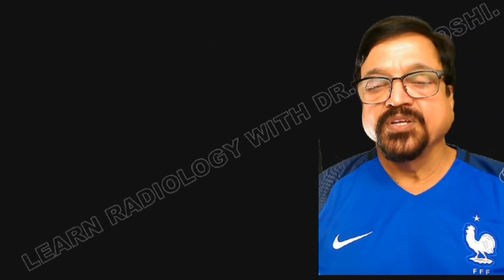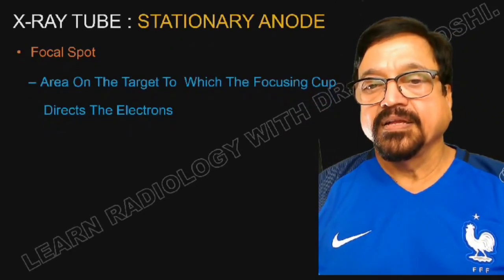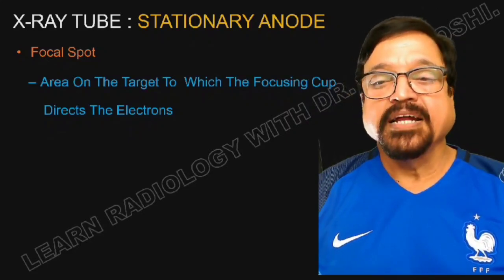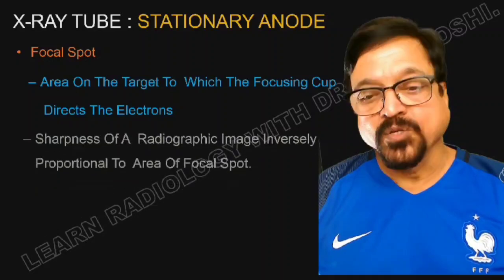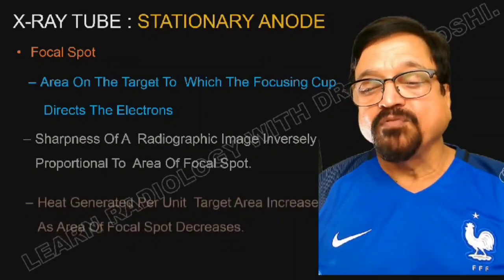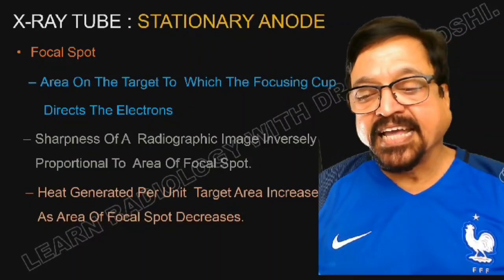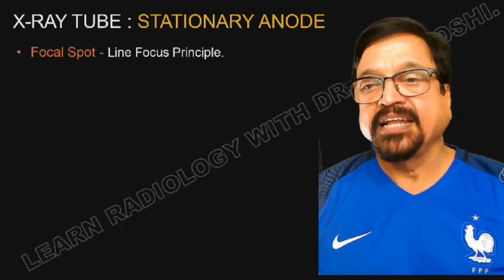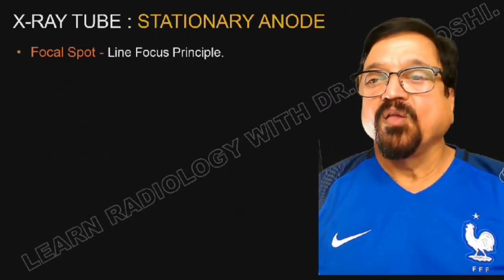This is the stationary anode design, how it works. Now the focus spot is an area on the target to which the focusing cup directs the electrons, or where the X-rays are produced. Sharpness of the radiographic image is inversely proportional to the area of the focal spot, and heat generated per unit target area increases as the area of the focal spot decreases. So these things need to be kept in mind.